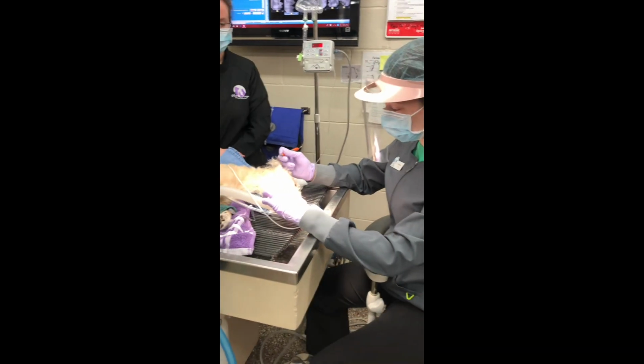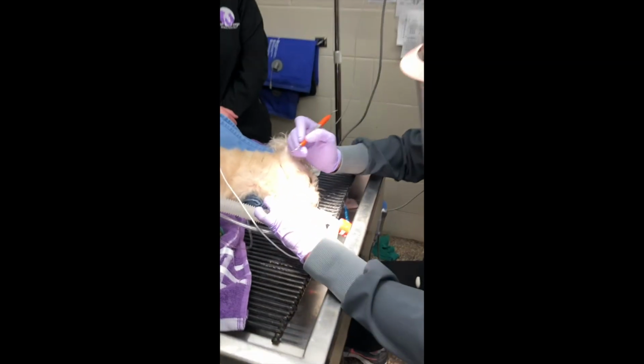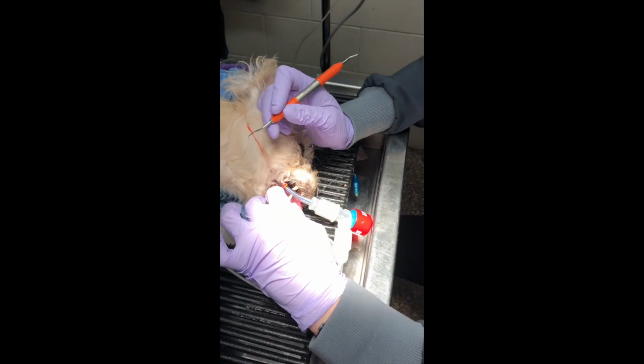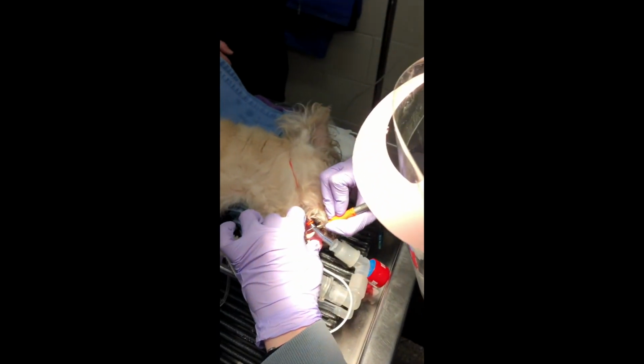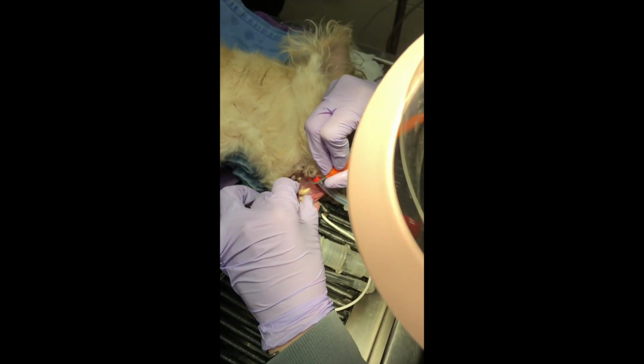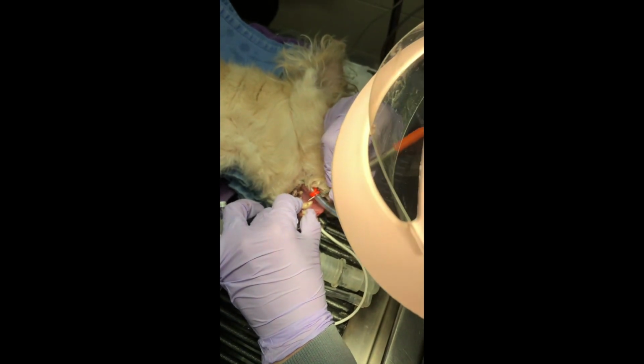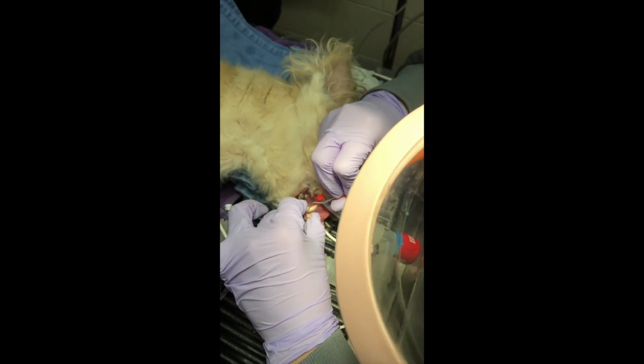Okay, I'm going to do hand scaling. I'm going to use a curette. This is used for subgingival scaling and supragingival scaling. So I'm going to go gently under the gum line, making sure that the blade of the curette is at a 45 to 90 degree angle, and gently make strokes down the crown of the tooth.